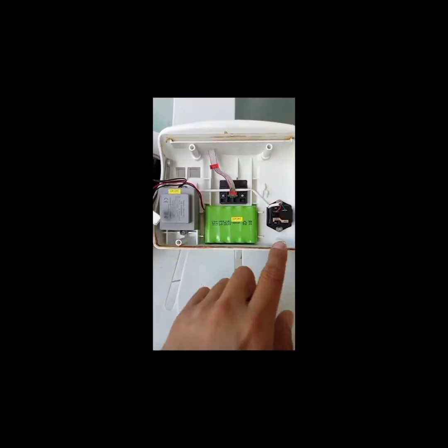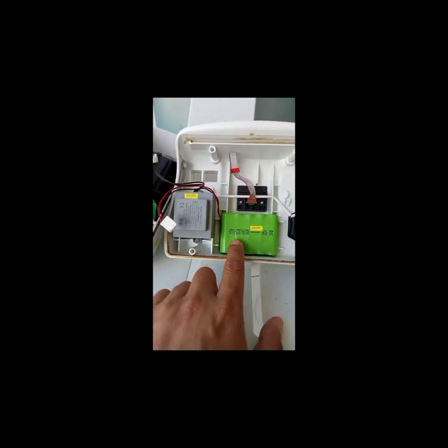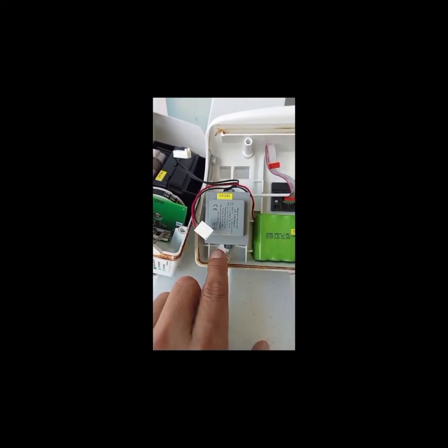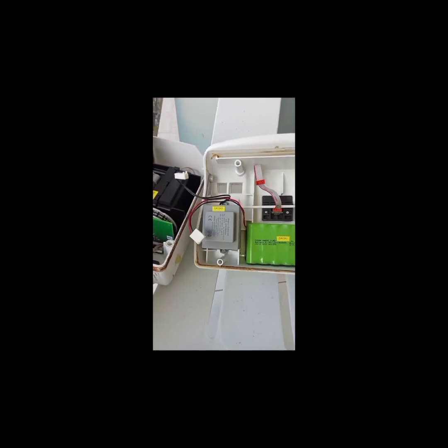Here you go. Okay, what we have here is the battery pack. It is inside the back of the Argos, and as you can see here, we have this AC power supply input, battery, and we have the compact transformer or the step down transformer from 230 volts down to 15 volts. And here are the main components of the Argos infusion pump.